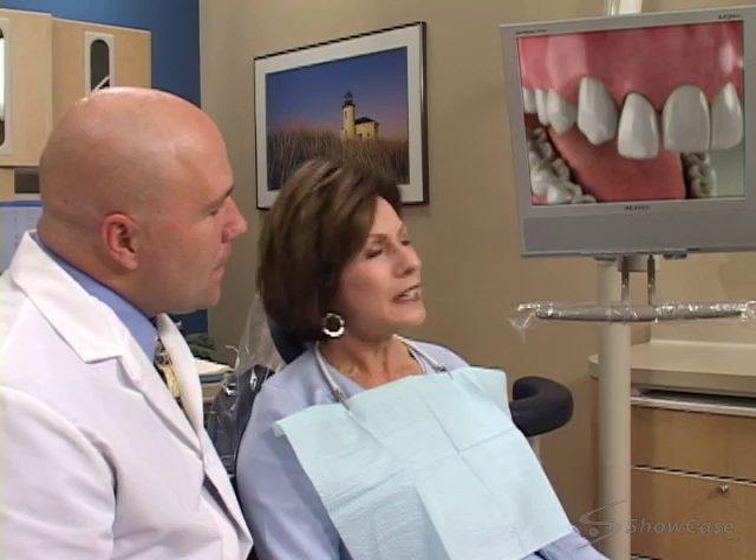When a tooth must be extracted, we can sometimes place an implant in the socket immediately after the tooth has been removed. Although each case will be different, placing the implant immediately after an extraction generally involves several phases.